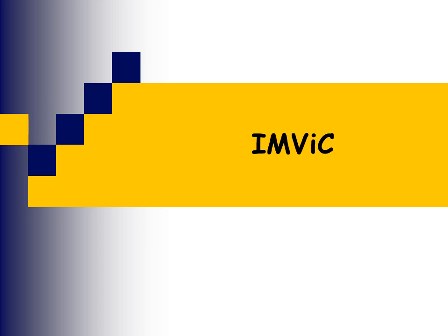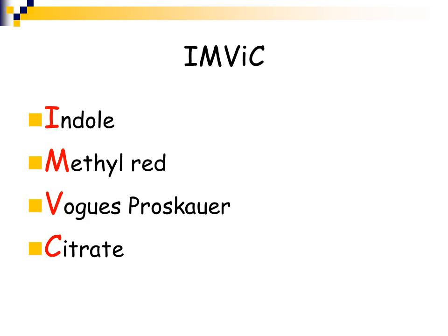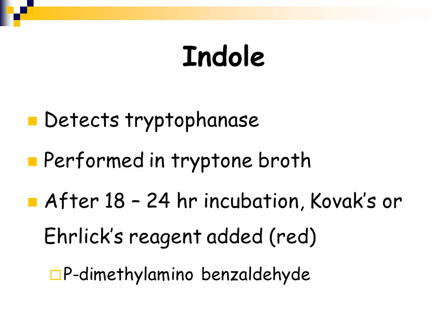The next set of tests is called IMViC. IMViC is an acronym for four different tests: the indole test, the methyl red, the Voges-Proskauer, and the citrate test.